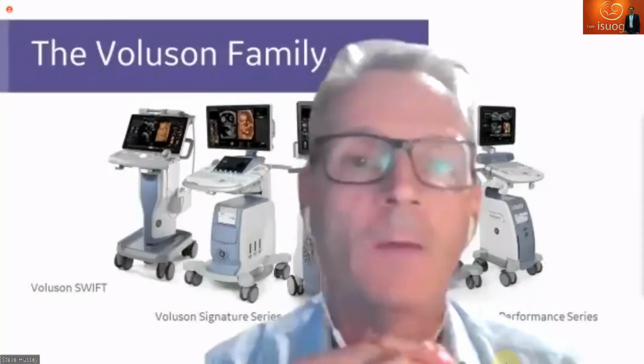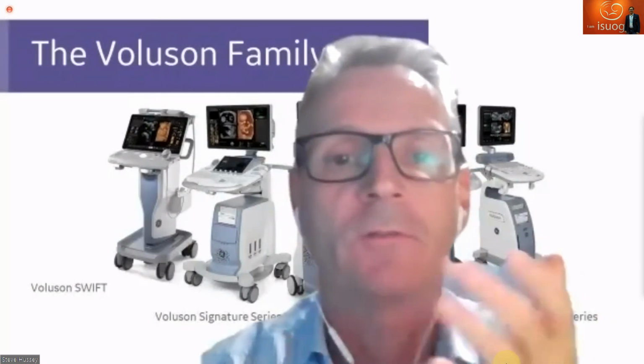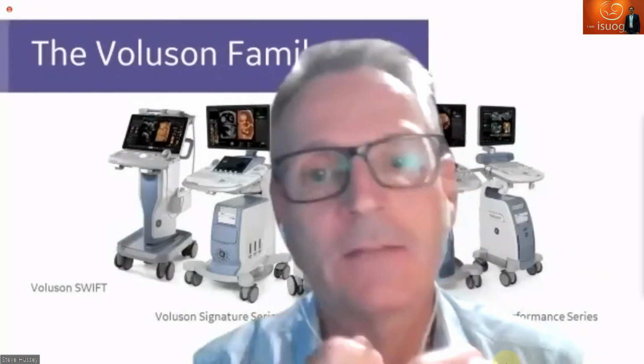Super. I have another question here. I think we've seen this one before, actually, on a few presentations. It seems quite controversial, but if there's a pericardial effusion, when is it significant? Is there a measurement you make on the pericardial effusion?